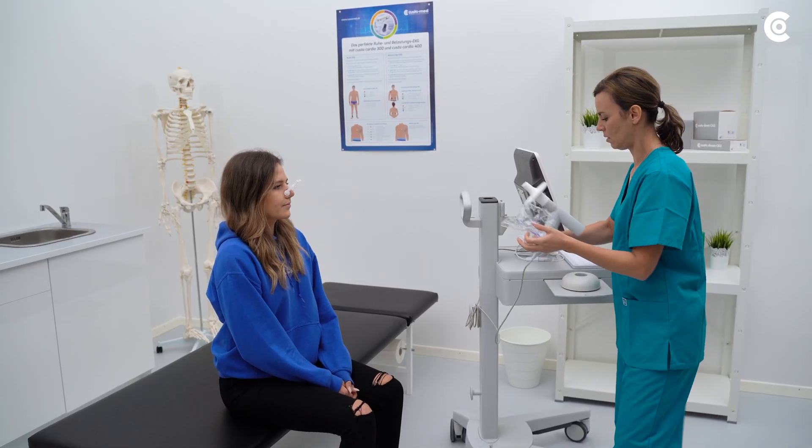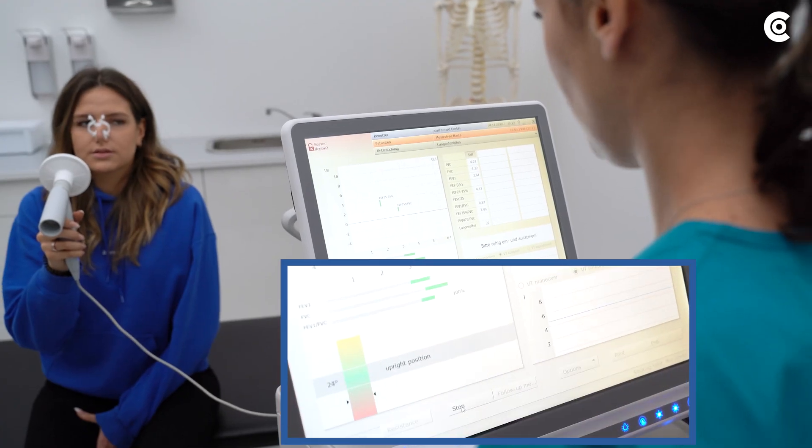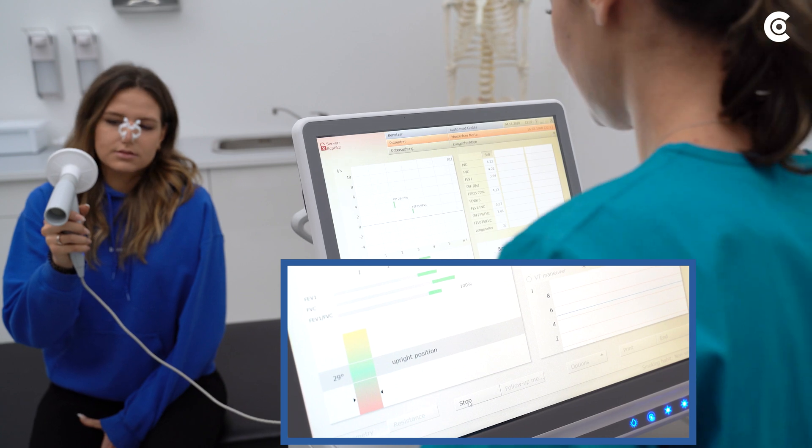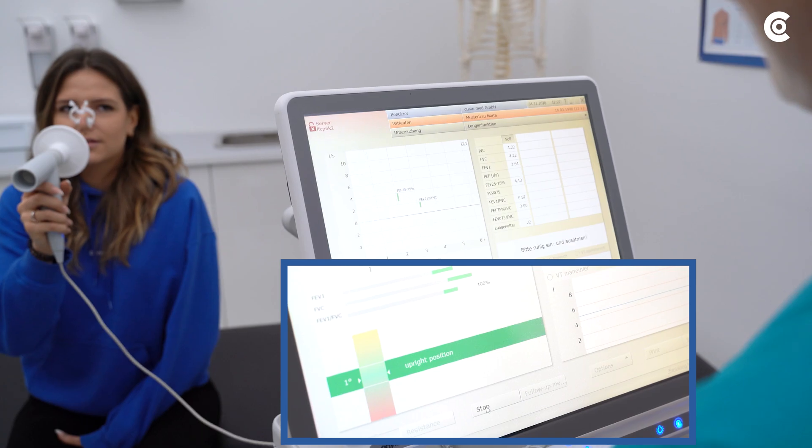Start the application and hand over the Spyro Mobile. Instruct the patient to use the CustoSpyro Mobile correctly, stressing that the device must be constantly held horizontally in front of their body. Also make sure that the patient's lips fully wrap the entire mouthpiece.